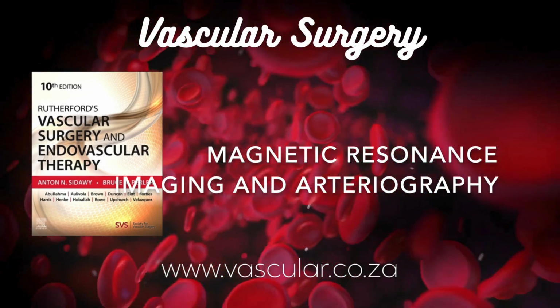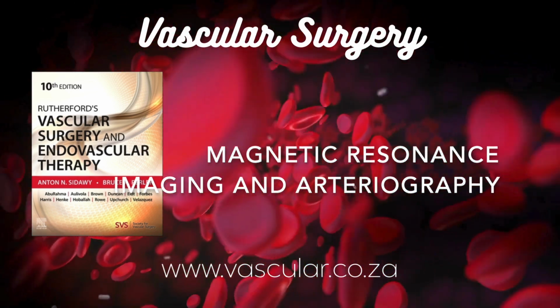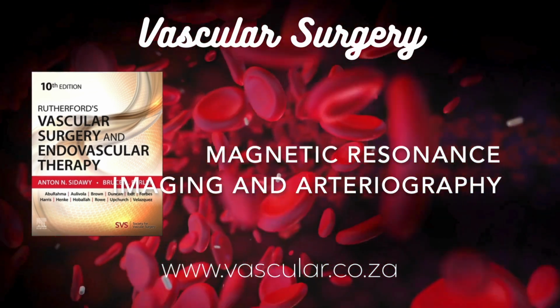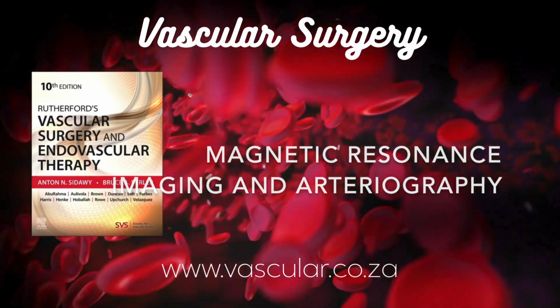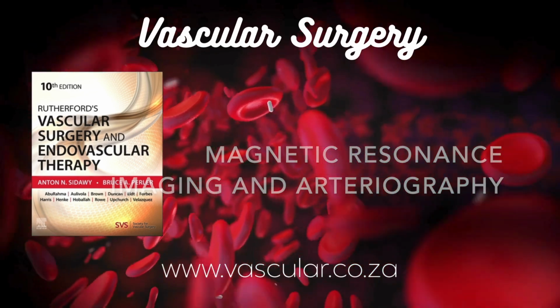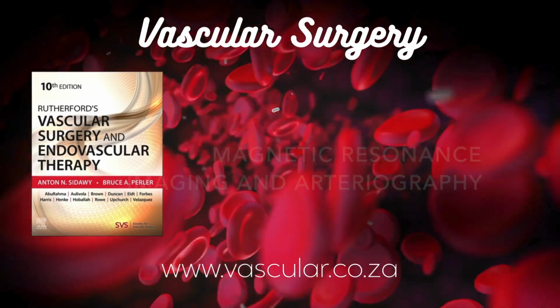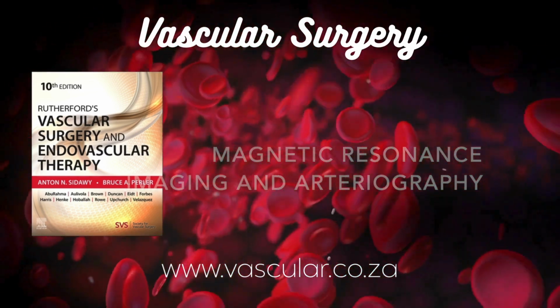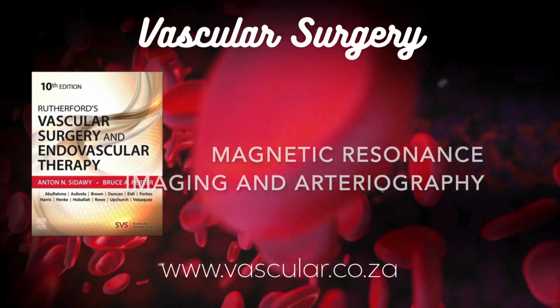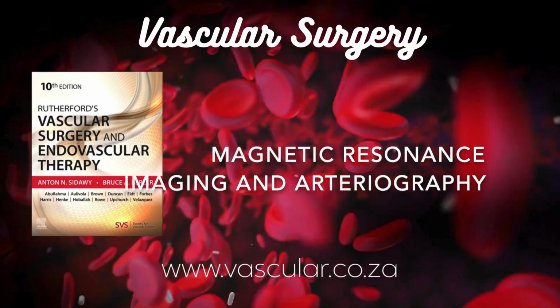For DVT, deep vein thrombosis. Exactly. It's highly sensitive for thrombus in the central veins. For the legs and pelvis, we often use that non-contrast 2D time-of-flight technique. Interestingly, MRV can sometimes find pelvic DVT that might be missed by ultrasound, especially if a patient has had a pulmonary embolism, but their leg ultrasound is negative. So it can find the source. Potentially, yes. Both the non-contrast TOF and post-contrast T1 images can be helpful for diagnosing DVT pretty much anywhere.